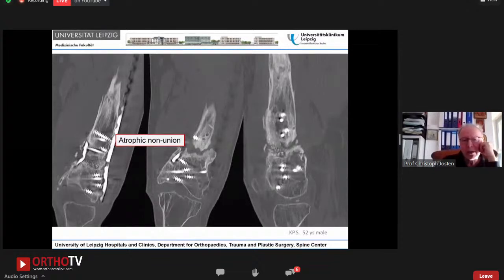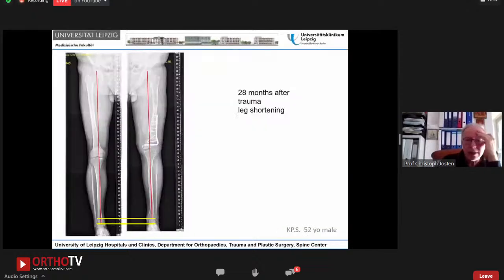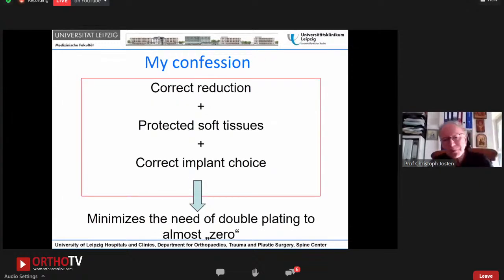And again, there was no complete consolidation. There was atrophic non-union, and we had to go back and remove all. We made a shortening with the angle stable plate in this case. And this is 28 months after trauma, a leg shortening in this case. So my confession is correct reduction, protected soft tissues, and the correct implant choice minimizes the need of double plating almost to zero. Again, you can attack me, you can criticize me, but this is my opinion and my philosophy, which has been very successful during the last decades, and I'm convinced about it.